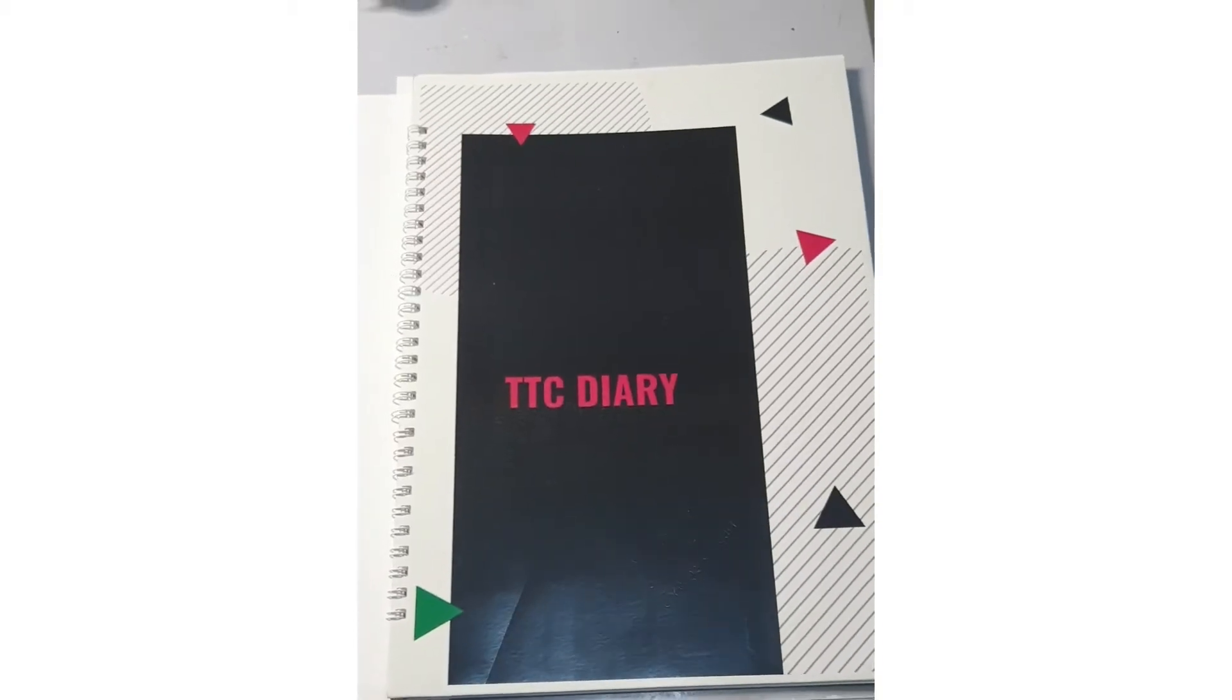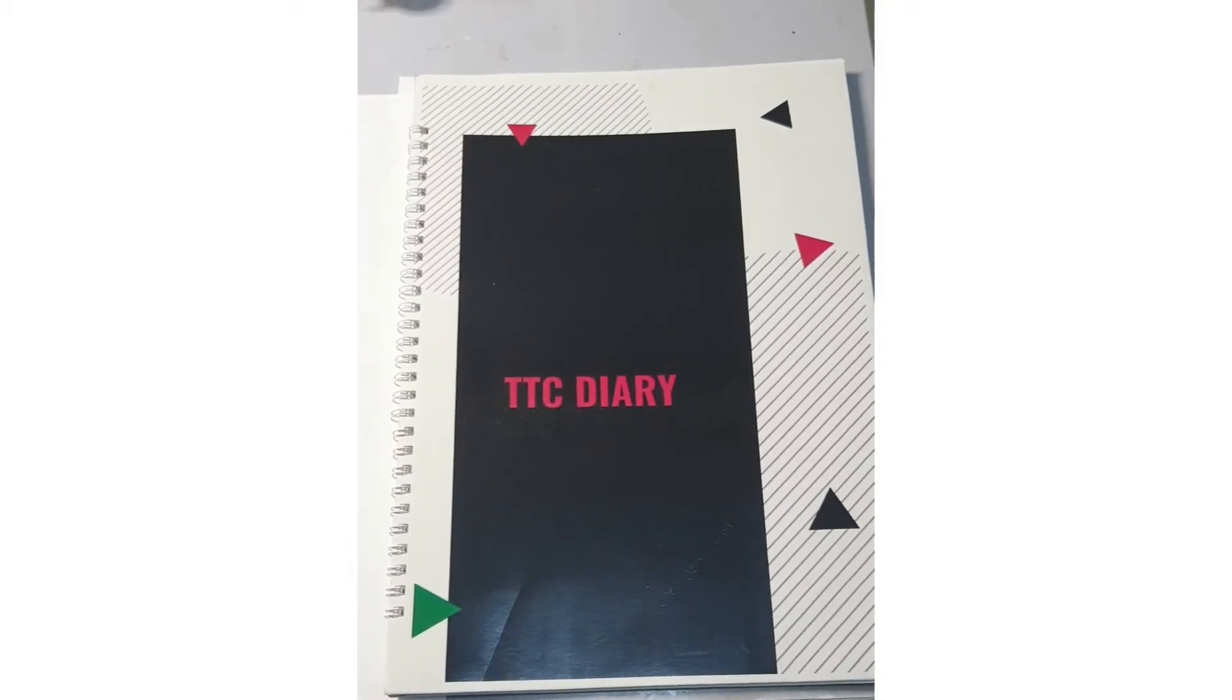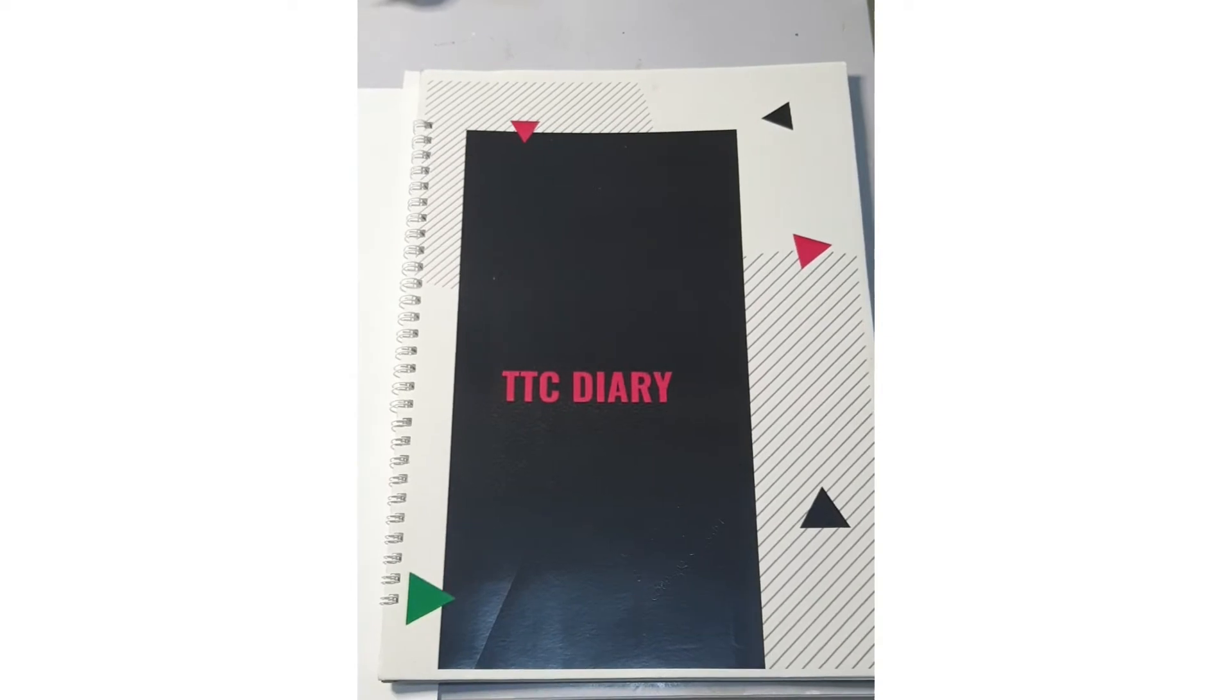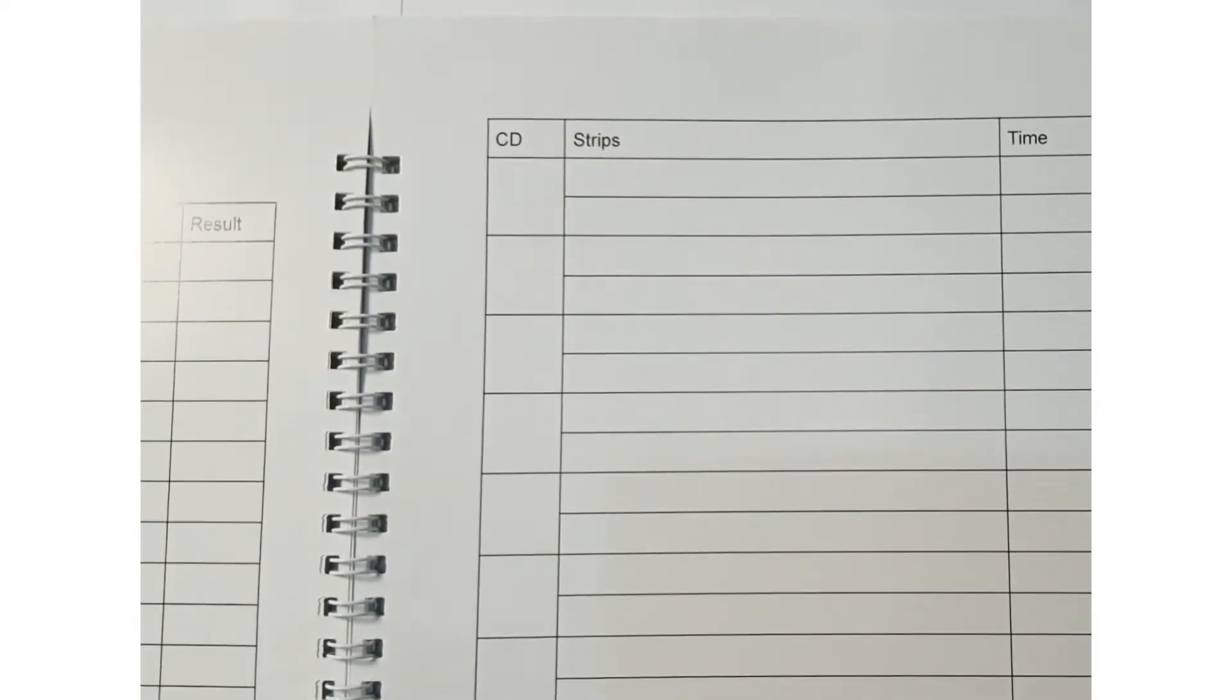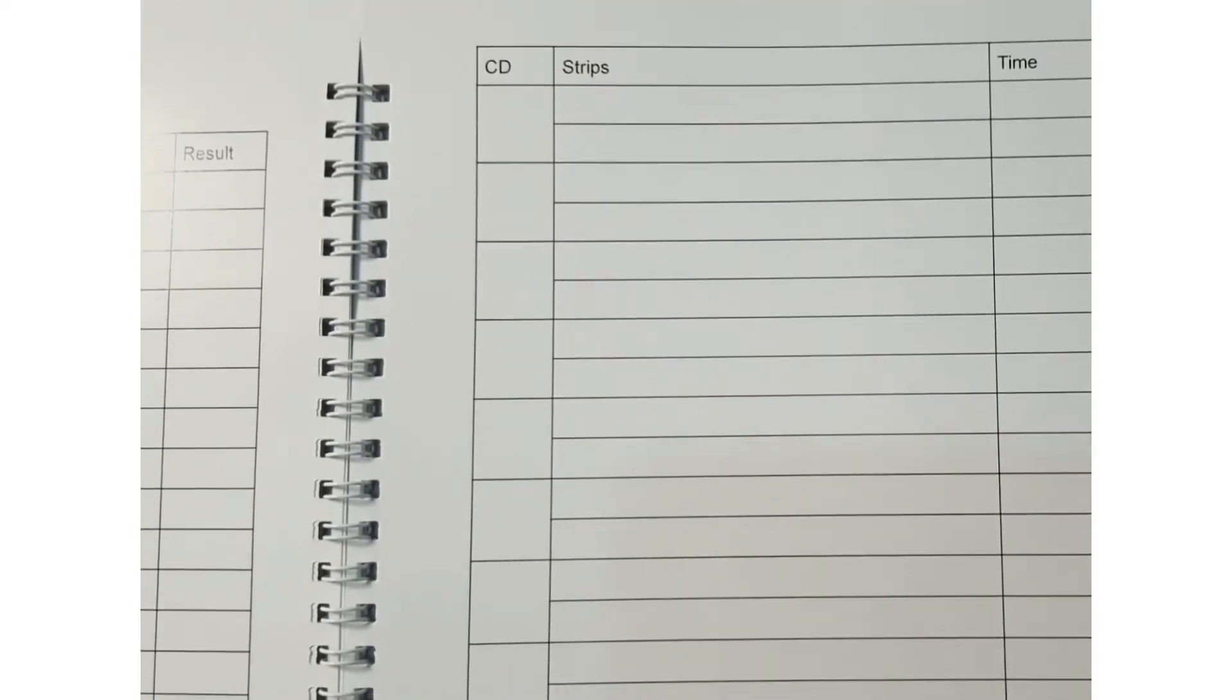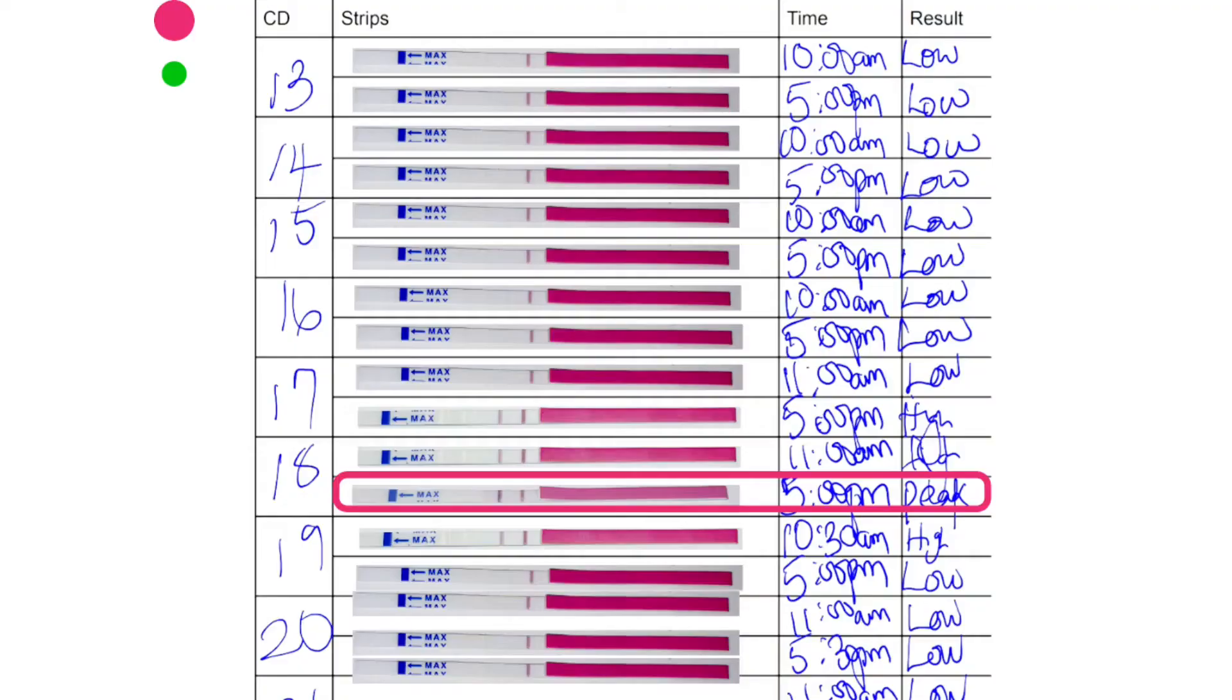Now, the TTC diary helps you to stack the results accordingly every day as you test so you can interpret correctly, just like this.